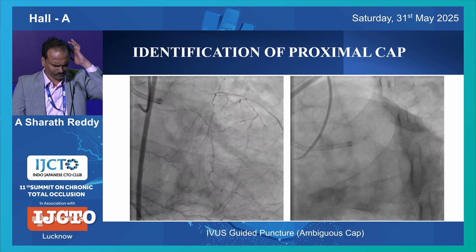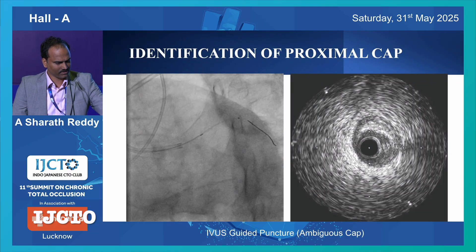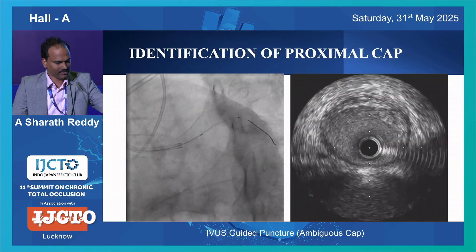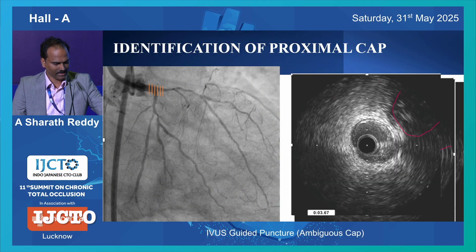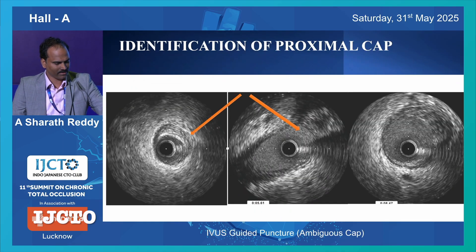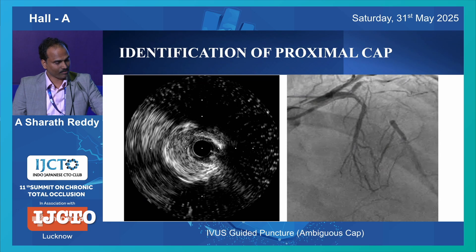Coming to the identification of proximal cap - in this case we can do IVUS from RAMUS, not LCX, again because of the angulation. Once you do IVUS, how to identify? You just look at the horizon. Something appears at 2 o'clock and then joins the main vessel confluence, and then there is the LMCA. You can see something up here, then that moves closer to your branch and then it joins - you can see the jump-in size of the vessel. The two important points are: one is disappearance of media, which locates the cap location, and second is the jump-in size of the vessel. These are the two important markers to locate your proximal cap.